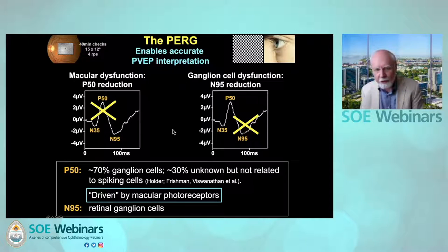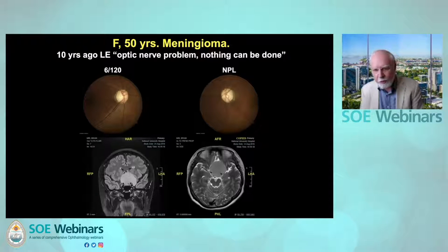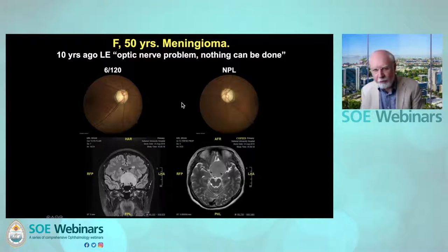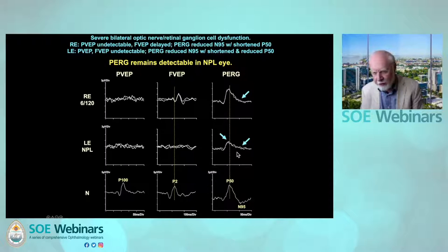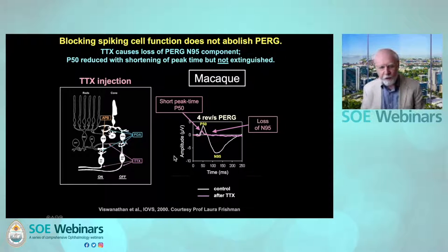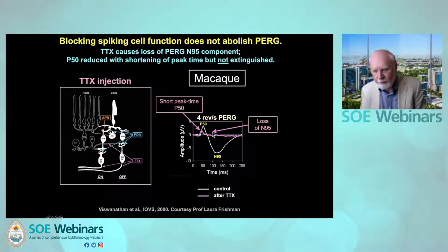The pattern ERG, therefore, enables accurate interpretation of the pattern VEP. It is important to remember that the pattern ERG is never extinguished by optic nerve disease. This is a case of a patient with a very large intracranial meningioma who has a blind left eye. But even in that blind left eye with no pattern VEP and no flash VEP, there is still a detectable response from the macula. However, P50 is smaller than its fellow eye, and there is marked N95 component loss bilaterally. There's also a shortening of P50 peak time. And if you look at the shape of this response, that's exactly what happens when you inject tetrodotoxin — which blocks all spiking cells — into the vitreous of a macaque: there is almost complete loss of the N95 component. P50 becomes shorter and smaller, but it does not become extinguished.